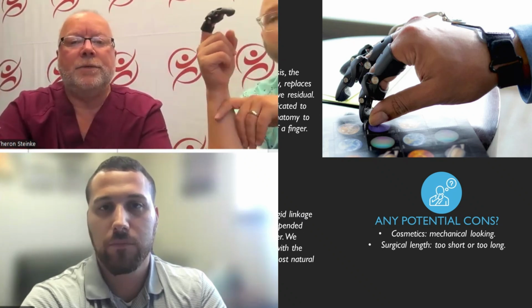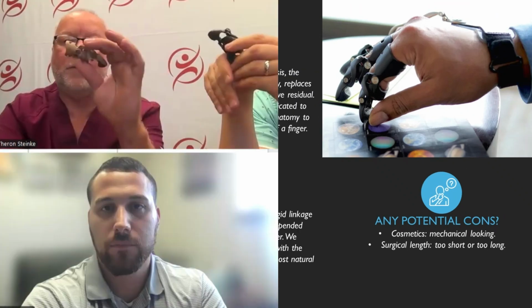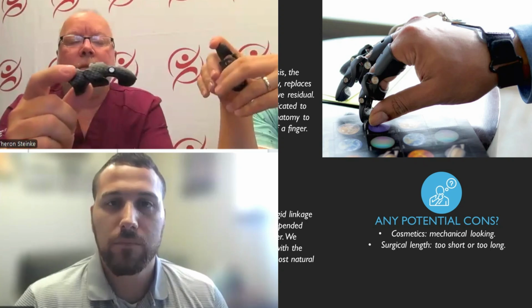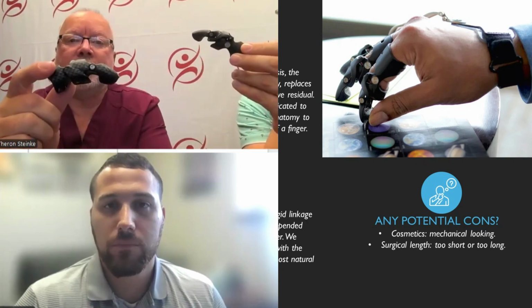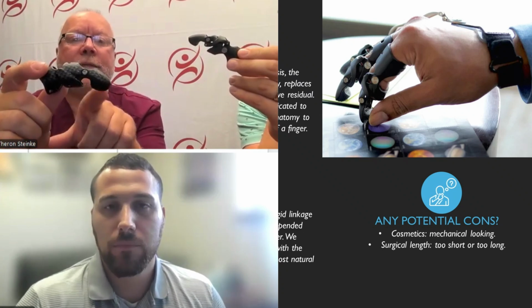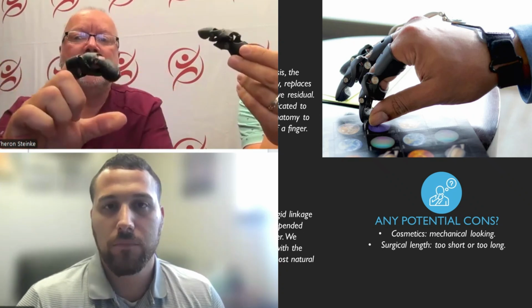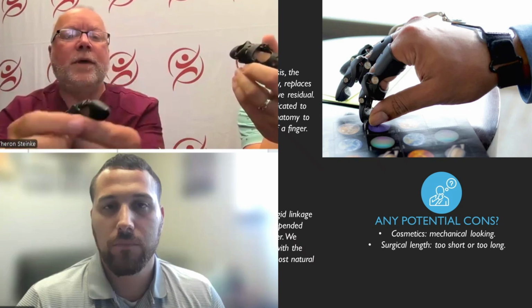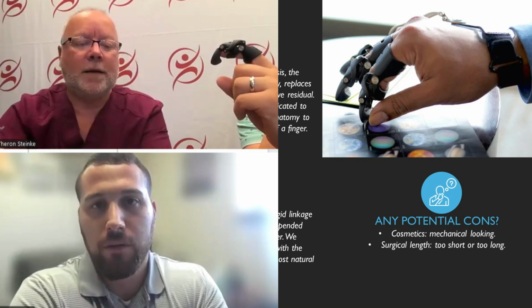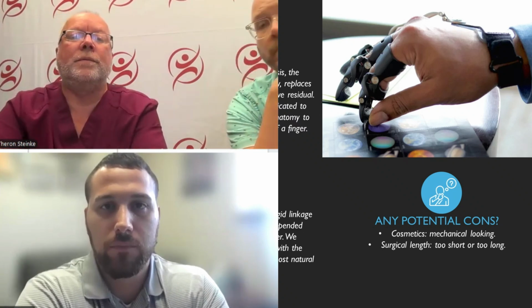And then the other con to it is if the amputation level was too short, then they wouldn't be able to use one of these. But if that happened, where the amputation was too short or they didn't have good flexion extension, then they have a fixed one like this. So what we would do is take this and have the angle that the patient needs built into it, and this one does not articulate. So they would just put that on and they would use the MCP joint to drive this, is how that works. Okay, so there is an option if it's not the limb length that we would prefer, there still is something else out there for them.